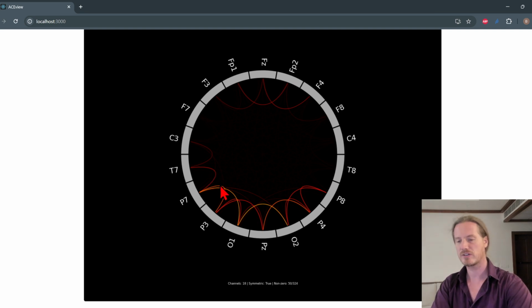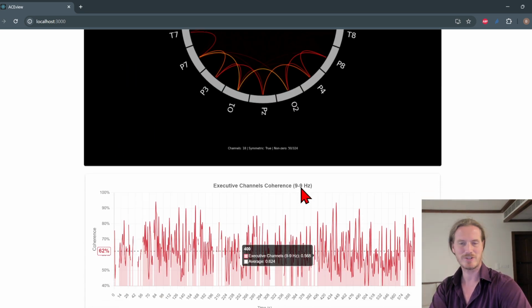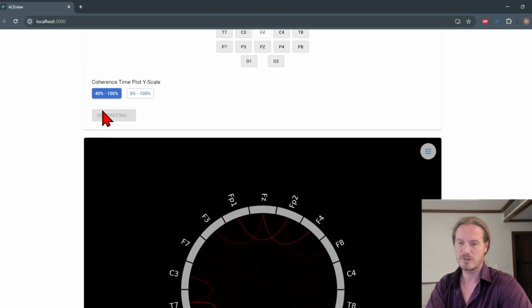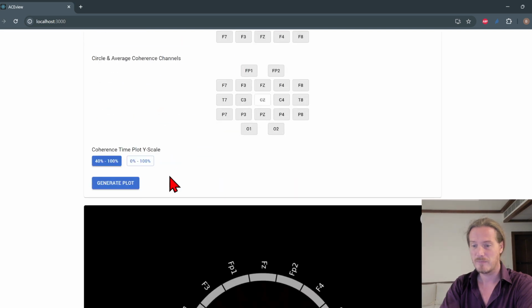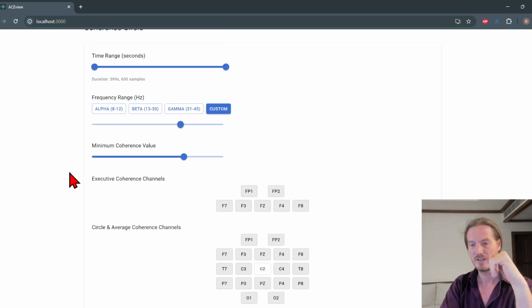This is what their coherence looks like when we added the additional channels, and we're only on 9 Hertz right now. Or perhaps we want to see them at 32 Hertz for whatever reason. It turns out he's got something going on at 32 Hertz. And so it's generating, it's pulling all of the data from that big sheet that I showed earlier. And so, of course, the coherence is not that high in this range. However, we're actually only showing coherence above 0.7, above 70%. And I can change that here as well.